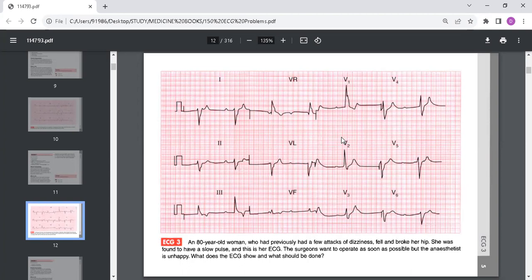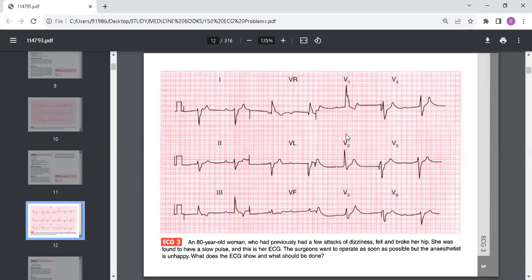In the absence of history suggesting myocardial infarction, this woman almost certainly has chronic heart block and the fall may or may not have been due to Stokes-Adams attack, a deep loss of consciousness due to this heart block. She needs a permanent pacemaker, ideally immediately. If permanent pacing is not possible immediately, we can use a temporary pacemaker. This is a classical ECG of complete third-degree heart block with dissociation between the P waves and the QRS.